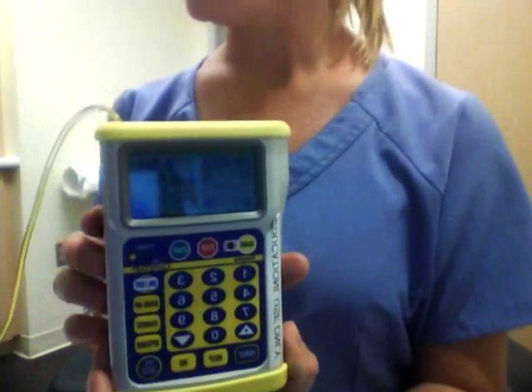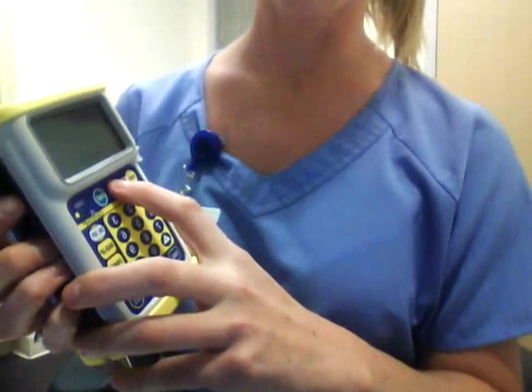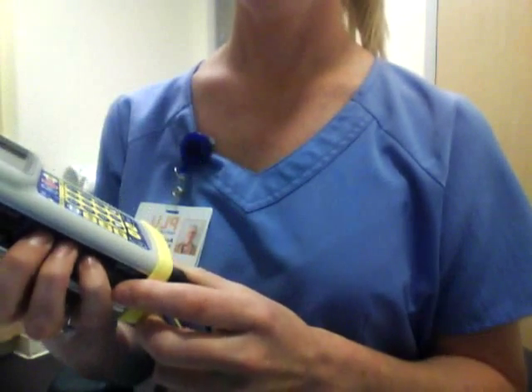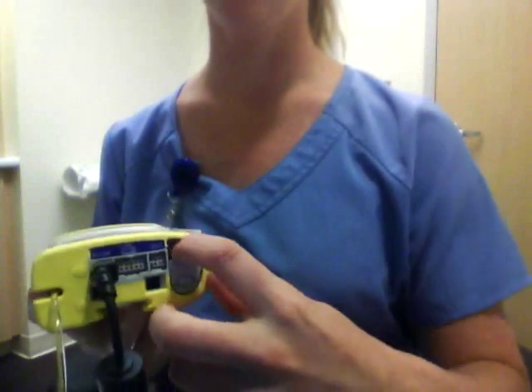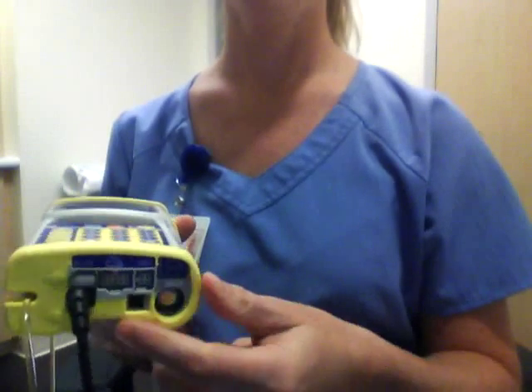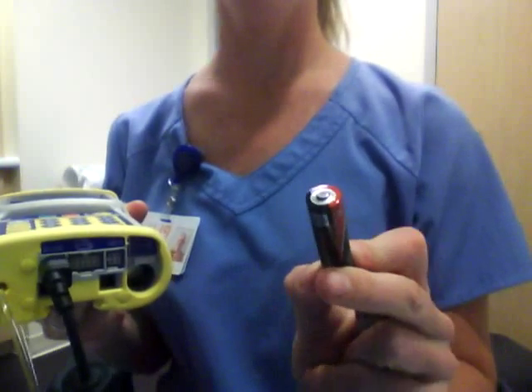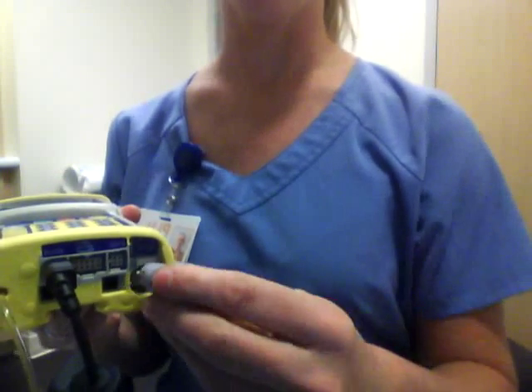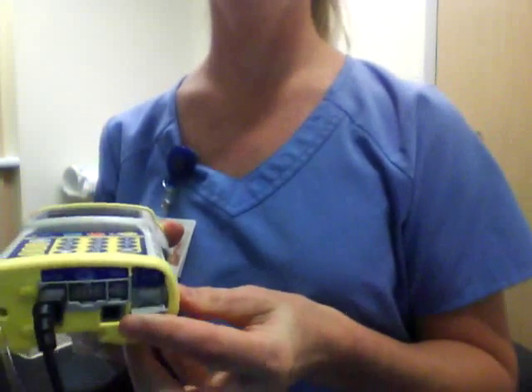The last skill we're learning in this video is changing the batteries. The pump has to be off in order to change the batteries, so you hit stop and turn the power off here. It will shut down. The battery door is located on the bottom of the machine under this gray tab — you just flip it up and then turn. The machine takes two AA batteries that are installed with the positive side up. Put the batteries back in, then turn the door and flip it closed.